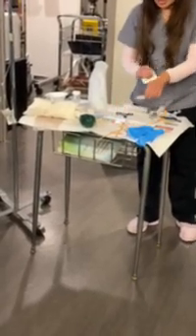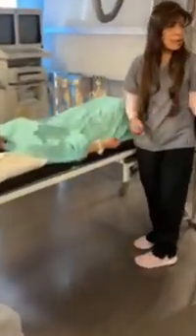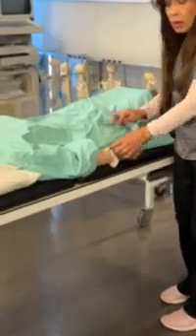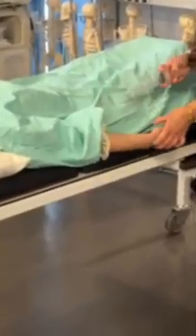So the doctor comes in, checks the needle. Both of you have already been punctured, so you know which vein and the whole procedure for doing this, what they need, what's required, right? So the radiologist comes in. Okay, how are you doing? How are you feeling? Pretty good. Okay, injects, goes.